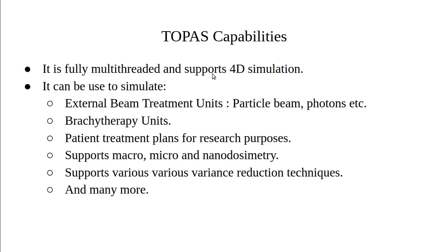Basically, talking about the capabilities of TOPAS, it is fully multi-threaded and supports 4D simulation. That is, it can be used in parallel processing. You can use multiple cores available on your system for your simulation to reduce your computational time, and it supports 4D simulation. That means it supports time as the fourth dimension, and you can do simulations for your gating treatments, like breath hold technique simulations, that can be performed using TOPAS.